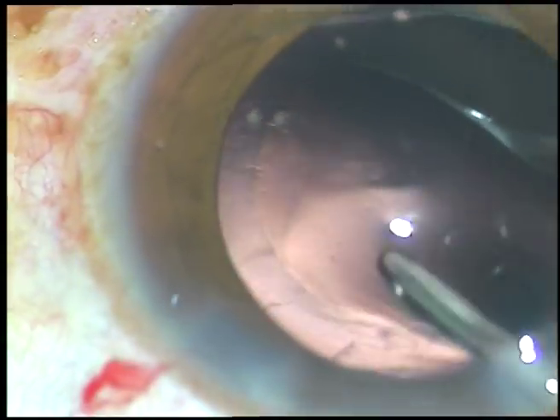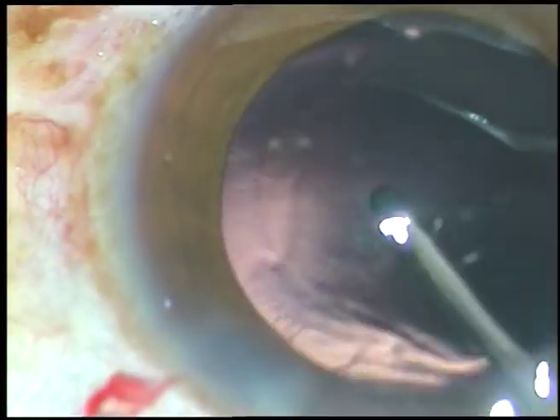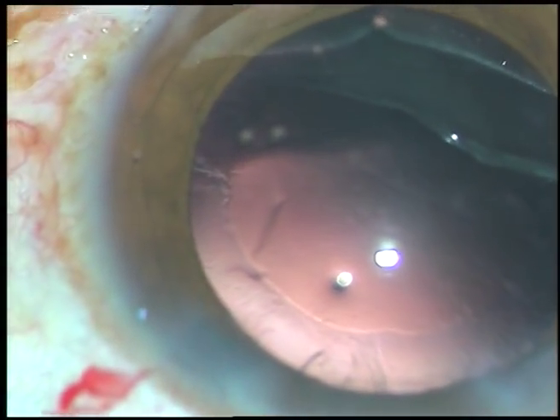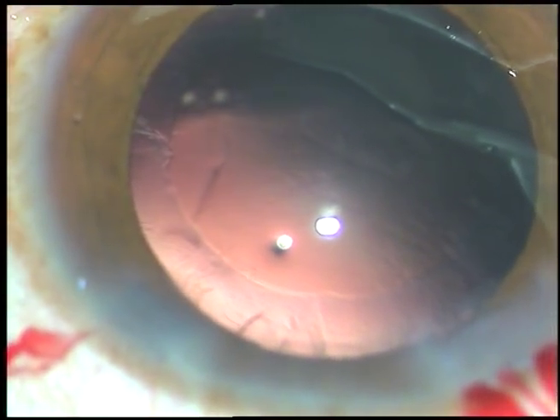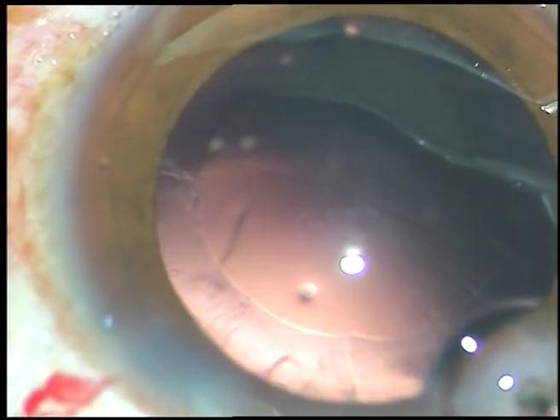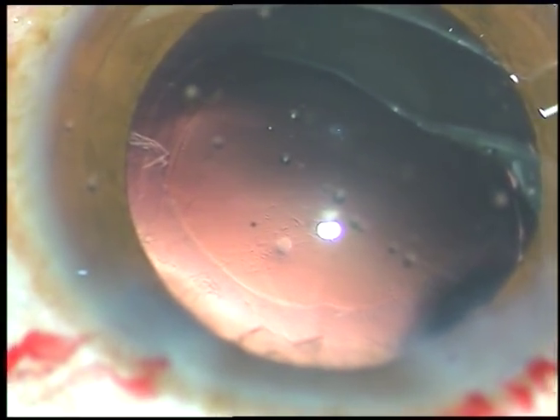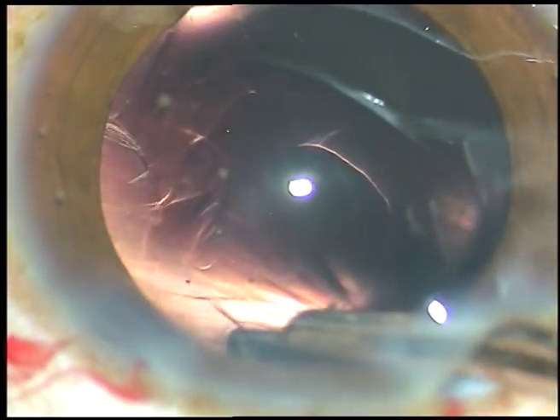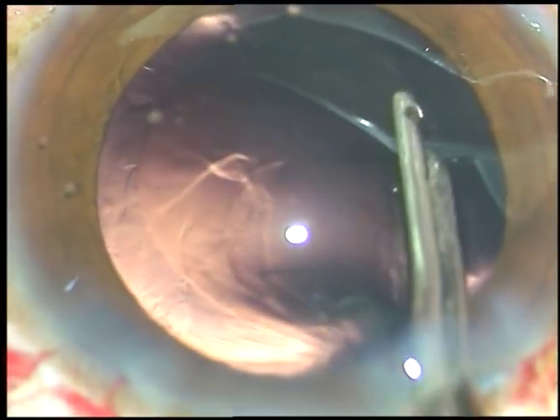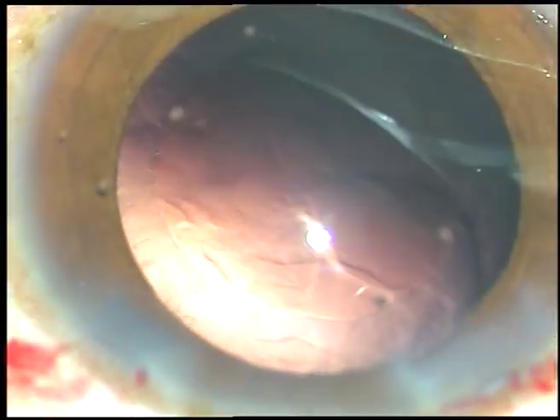Now you can see some cortical matter at around 12 o'clock, just on the left side of the main incision. To remove this cortical matter, if I use the Simcoe cannula without viscoelastic substance, the anterior chamber will be very shallow. So I inject some viscoelastic substance in the capsular bag and in the anterior chamber, and now I use the Simcoe cannula to remove this cortical matter. This viscoelastic substance has kept the anterior chamber formed and the endothelium protected. At every step, please keep the anterior chamber formed.